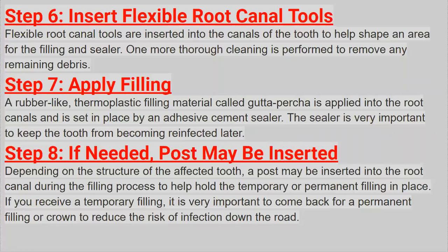Step 8, if needed, a post may be inserted. Depending on the structure of the affected tooth, a post may be inserted into the root canal during the filling process to hold the temporary or the permanent filling in place. If you receive a temporary filling, it is very important to come back for a permanent filling or crown to reduce the risk of infection down the road.